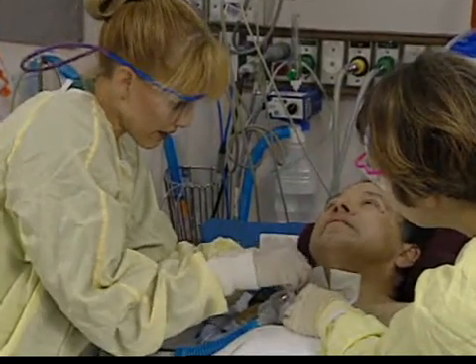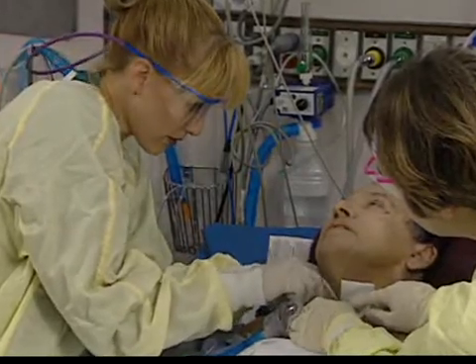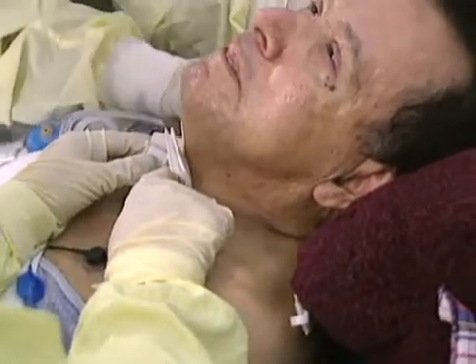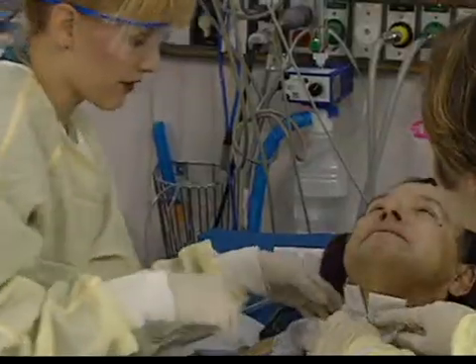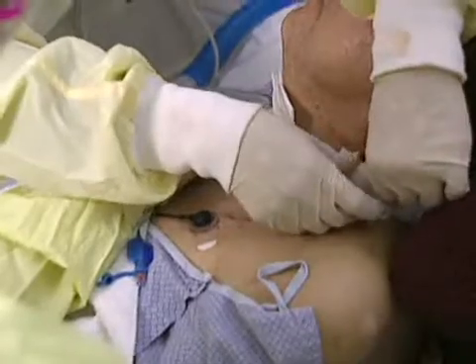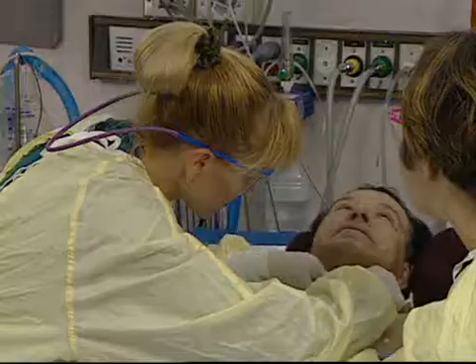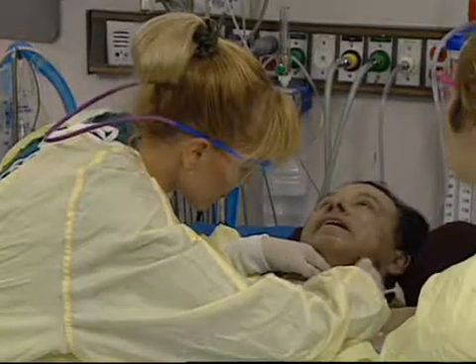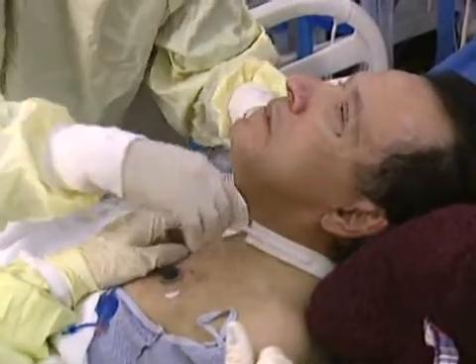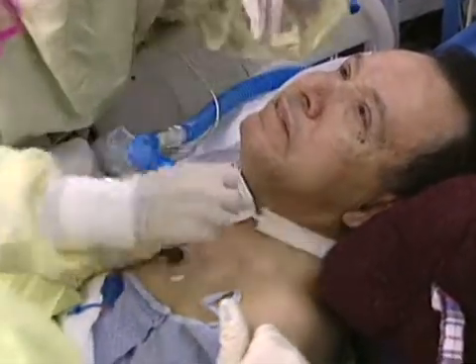Now that you're holding onto that trach, what I'm going to do is this little hole that's on the side of the flange right here, I'm going to pull this all the way tight and lay it down flat onto that, and we'll do the adjustments with this side. Okay? So I'm going to do the Velcro here. You doing okay, Mr. Gonzalez? Okay. Let's see. And it's a little too loose. Let me see if I can tighten this any further.